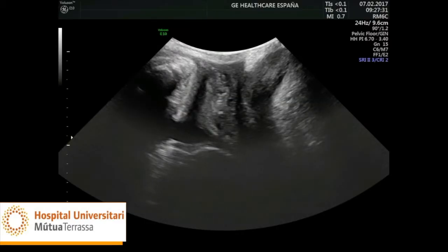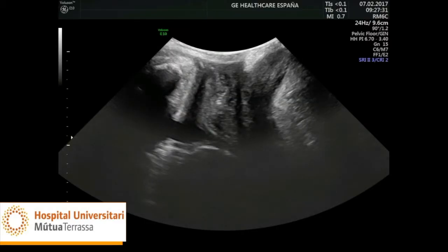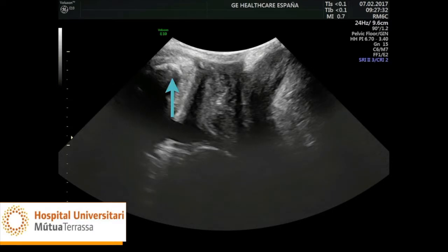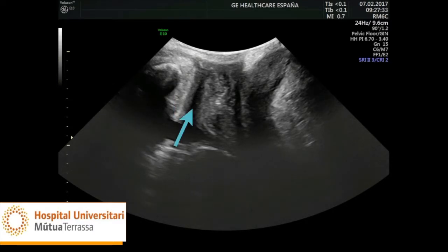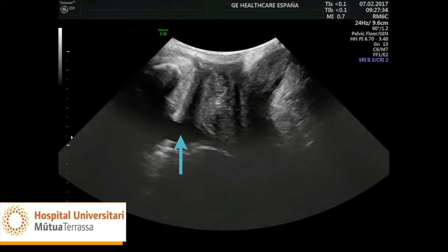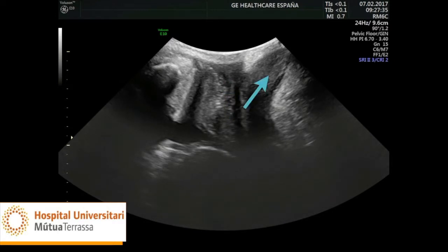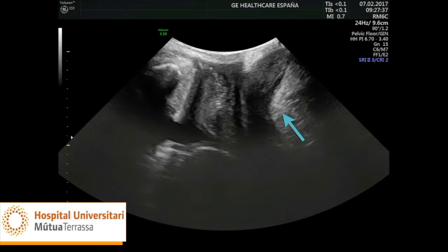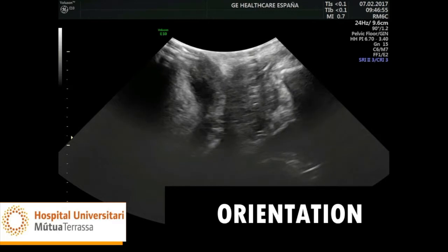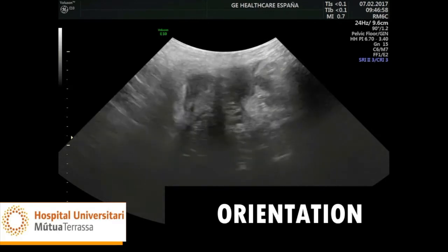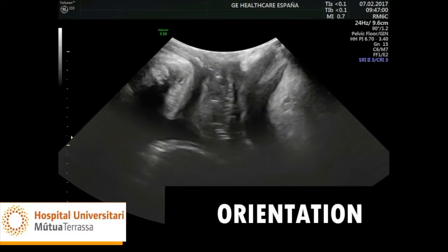The two-dimensional plane of section in the sagittal plane is the same in both probes, allowing the user to see from left to right: the pubes, the urethra and the urethral sphincter, the bladder, the vagina, the anal canal, the rectum, and the lowest part of the levator ani muscle. A fairly common error is using the probe back to front. If we do not see the image in the typical plane of section, we should consider this possibility.